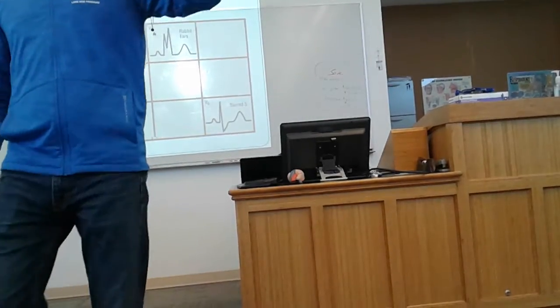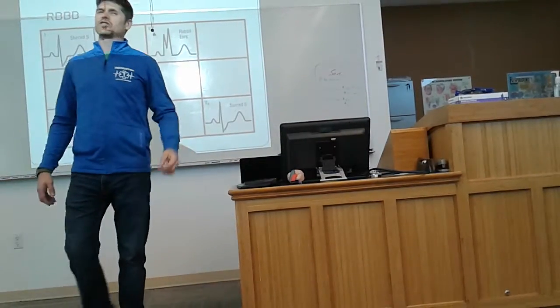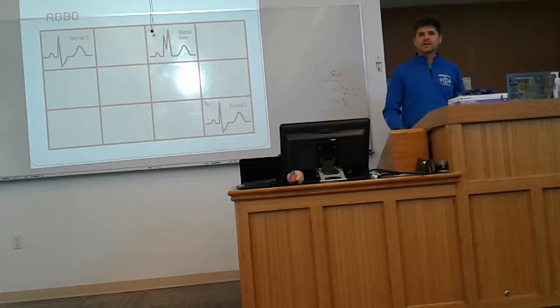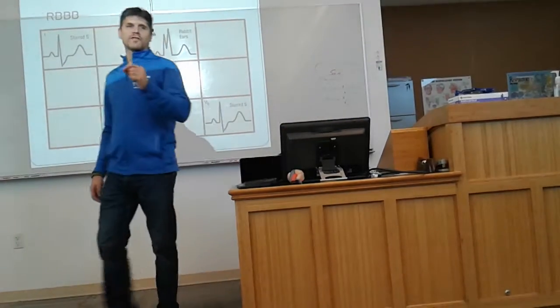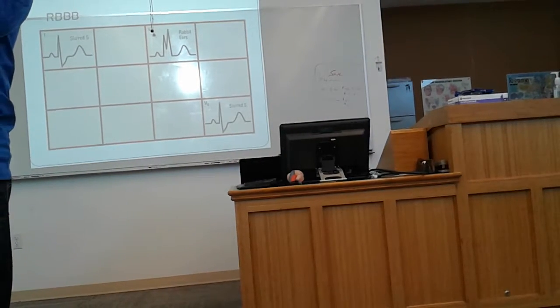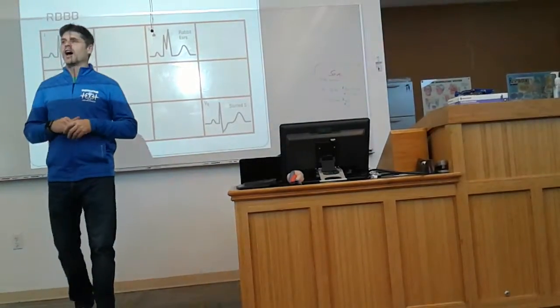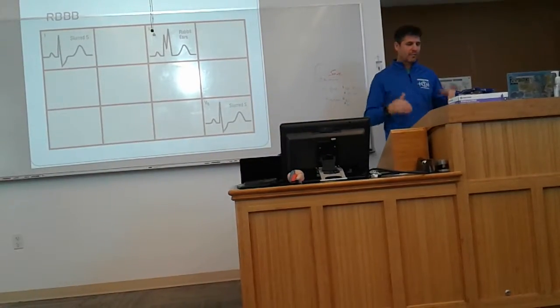Okay, so we're going back to Sarah's question, which is, well, AVF really doesn't show me that it's really wide, does it? Is it wide in AVF? Most likely, I just can't see it. Because in a biphasic lead, our options for biphasicness is equal up and down or what? Nothing. Or nothing, and you might have a combination within that lead. So your biphasic lead will never be a good lead to look in to try to give accurate measurements.